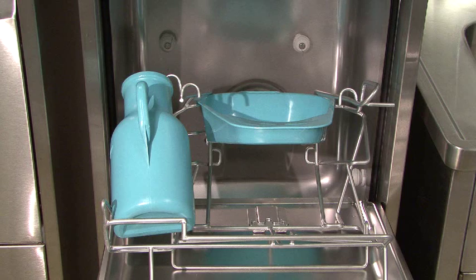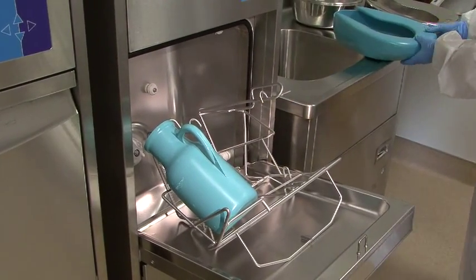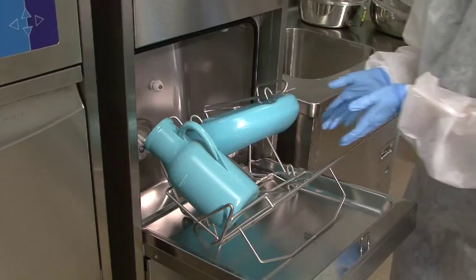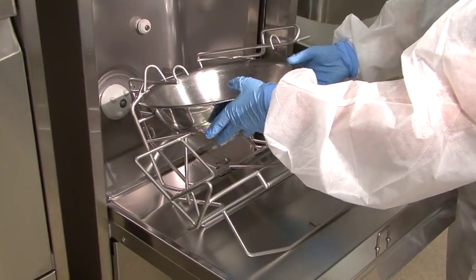A urinal and a slipper pan can be washed at the same time, as can a urinal and a bedpan. A wash basin and a kidney pan can also be washed together.